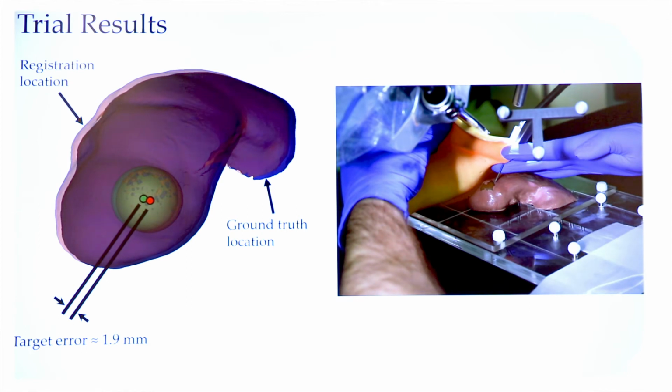From this trial, we can conclude first that this surface-based registration can be sufficiently accurate for image guidance, but also we've leveraged the Da Vinci in order to achieve this image guidance without needing any other hardware in the operating room.